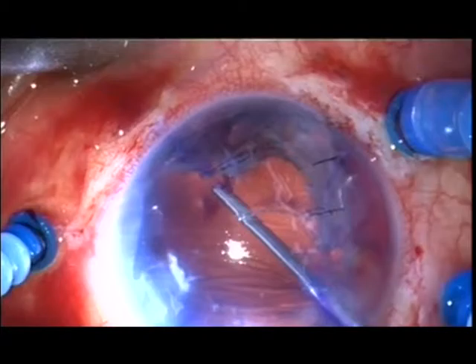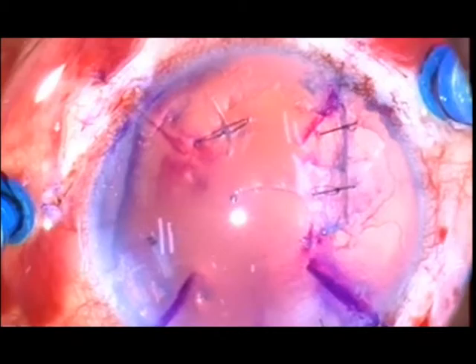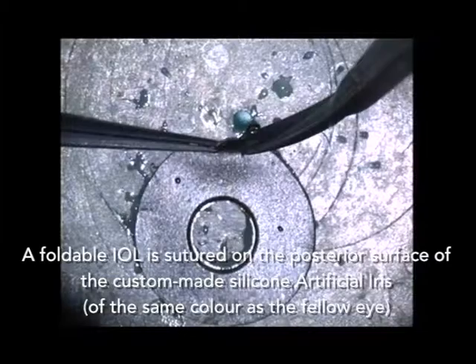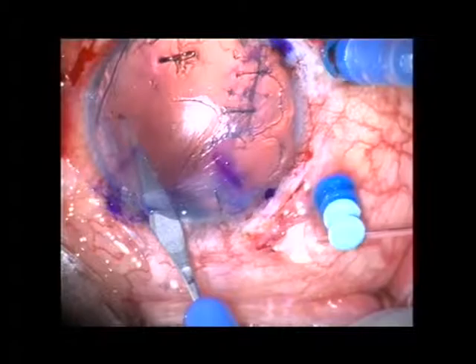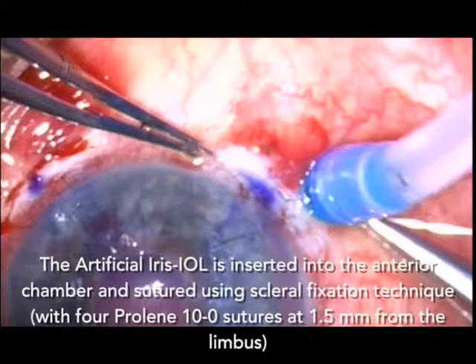Now let's focus on the anterior segment reconstruction for the simultaneous correction of post-traumatic aphakia and aniridia. Four scleral pockets are prepared. A foldable IOL is sutured on the posterior surface of the custom-made silicone artificial iris of the same color as the fellow eye. The artificial iris IOL is inserted into the anterior chamber and sutured using scleral fixation technique, with four Prolene 10-0 sutures at 1.5 mm from the limbus.